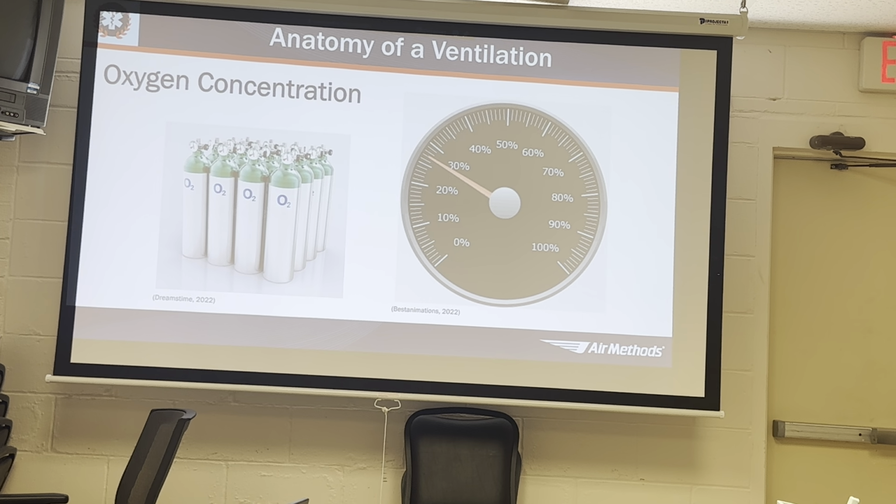So, oxygen concentration. A lot of times we put our patient on an FiO2 of 100%, and then we just leave them there, right? When's it time to pull back that FiO2? Really, you can base it off your ABG, or if they're sitting there sating at 100% for 30, 40 minutes, it's probably time to start bringing back that FiO2.